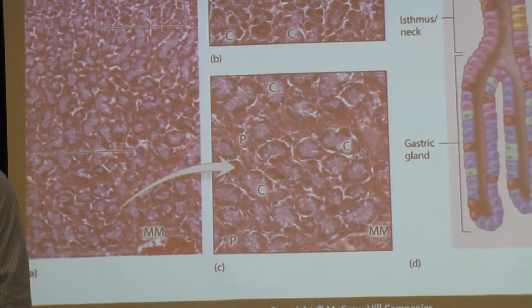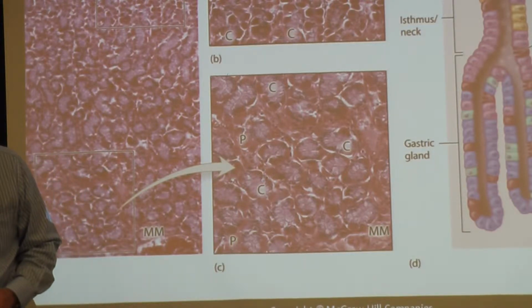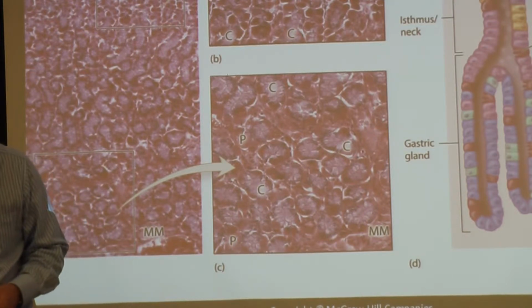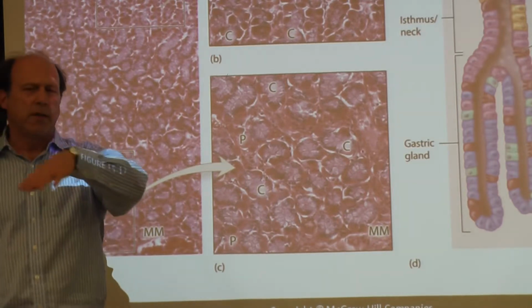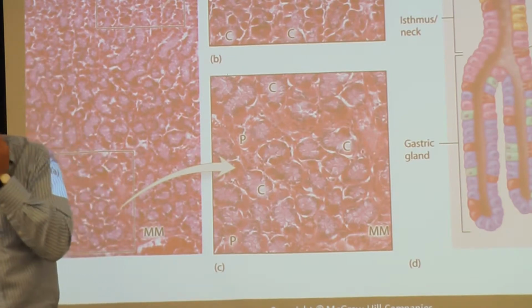And so one of the things that they can do is they can signal other cells using some neurotransmitters, and typically that's serotonin, which stands for 5-hydroxytryptamine, or 5-HT, they talk about it sometimes. It's interesting because of the work that I've done with this. I'm going to be giving you guys some sections of small and large intestine here in just a minute.